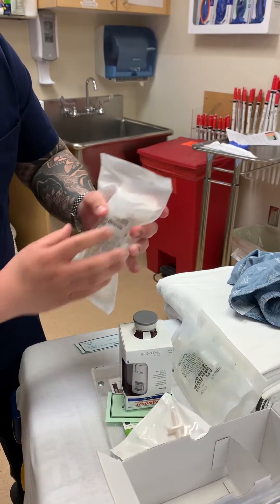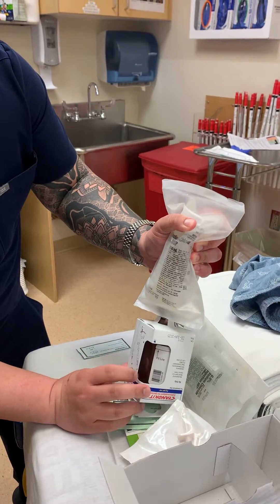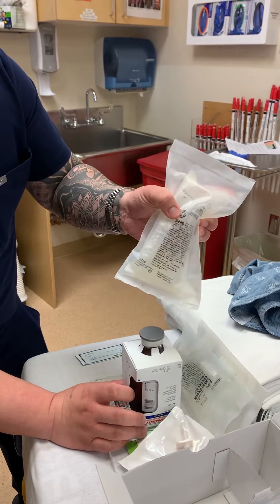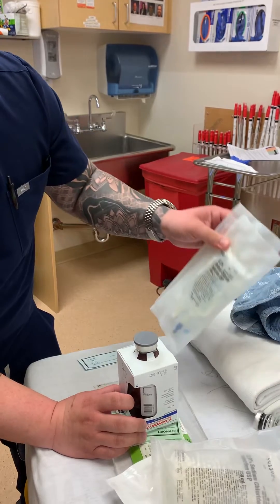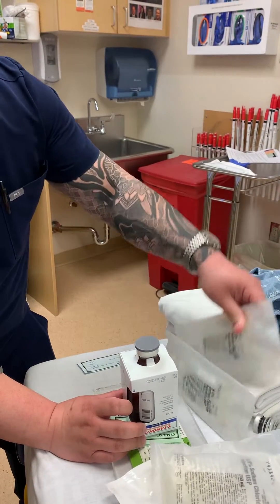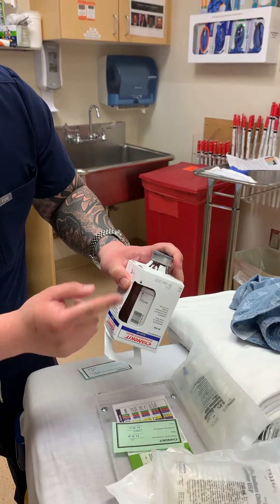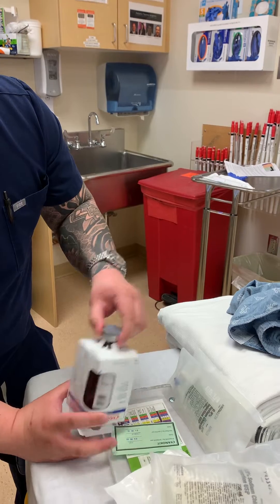To help get the fluid in faster, just squeeze the bag and watch the fluid level until you hit that fill line, since this is a 250 mil bag. Alternatively, you can grab two 100 mil bags if you don't want to have to pay attention to the fill line or can't see it. If you have access to 200 mil bags, that may be faster.